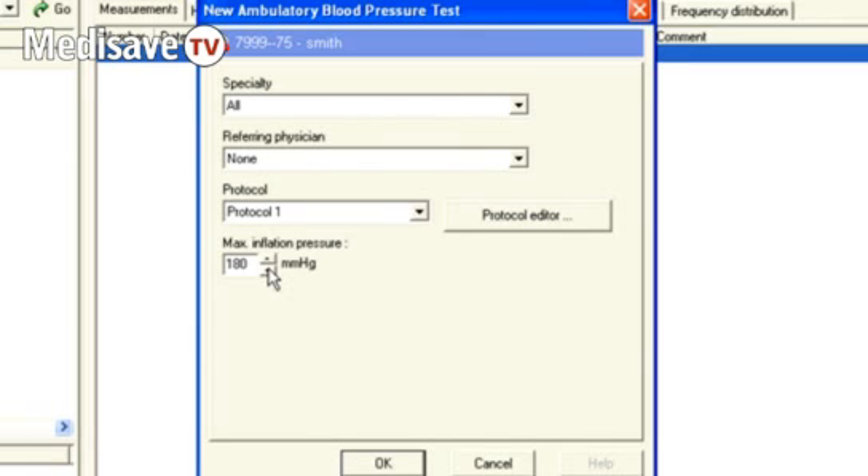When the unit first inflates, it'll go to 160 millimetres. And if it doesn't get a reading at that level, it'll wait a couple of minutes and then try again at 180. If it doesn't get a reading there, it'll wait a couple of minutes and try again at 200. It will keep going up until it gets a reading or until it reaches the inflation pressure limit you've set.